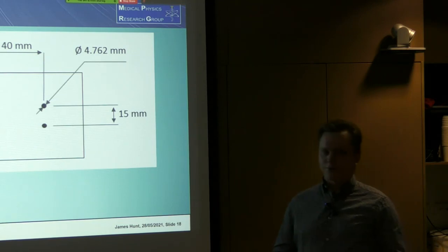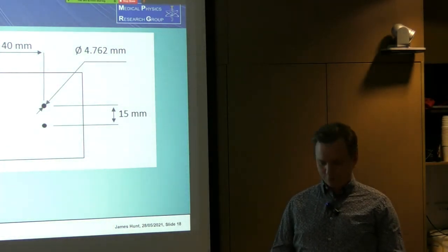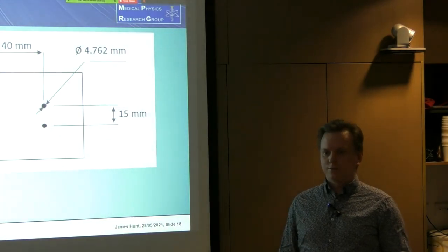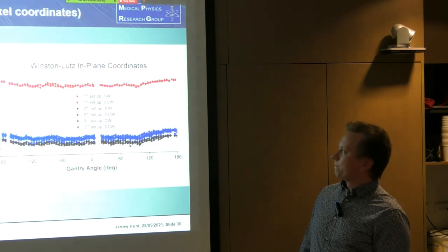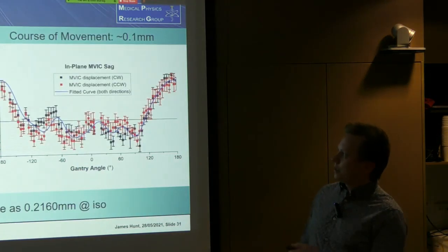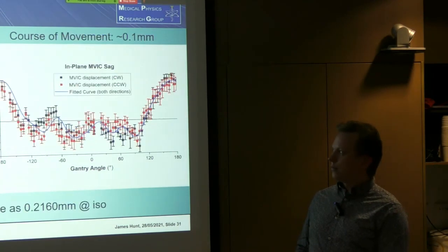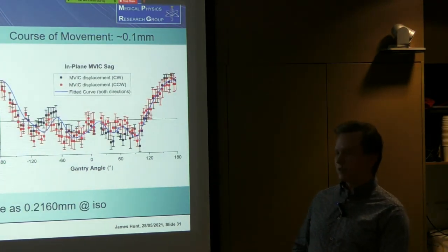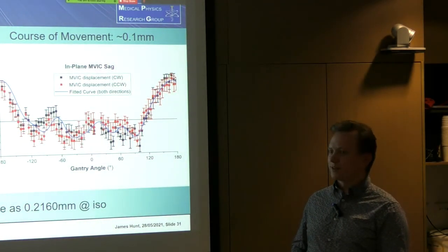Okay, thanks. No worries. Any more questions, Jake? You mentioned that your results were reproducible because you did the measurements twice. Did you present that on there? You can see once they're here, they're all kind of together. Here's the 3 different setups. Once I subtract the harmonics of each one, they all have separate harmonics, and the data all sort of join together. I presented it as average and standard deviation, so there is a lot of data points within each of those data points.